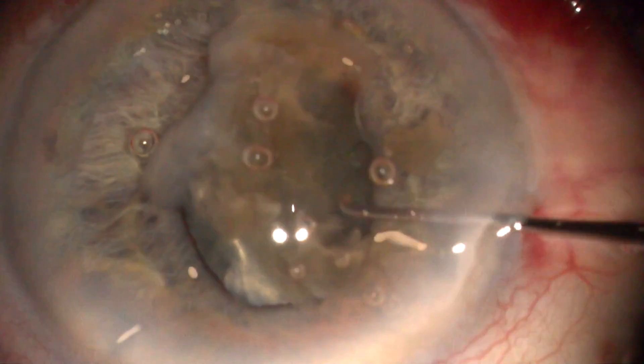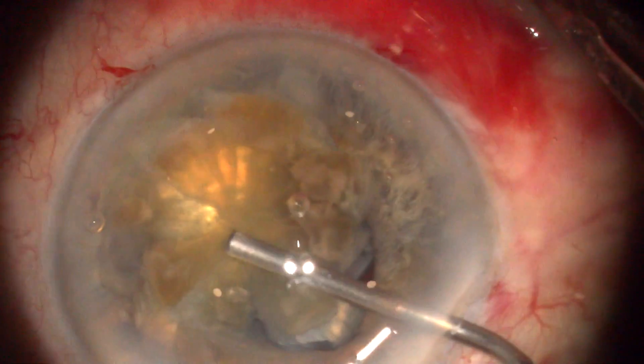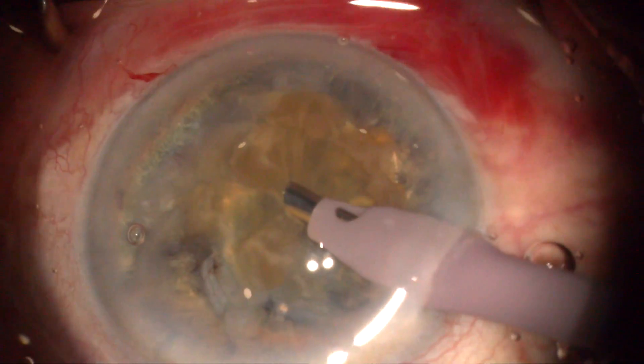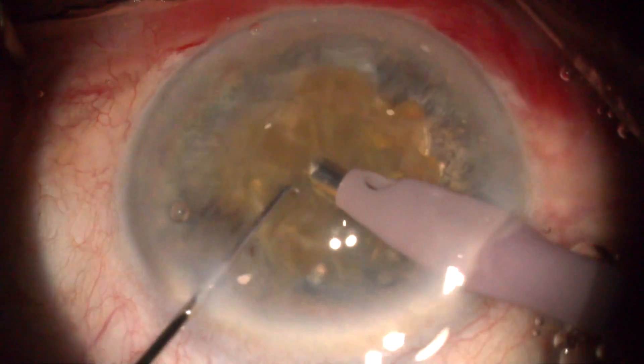Dispersive OVD isolates the posterior capsule. The posterior plate is brought into the anterior chamber for illustration purposes. Small ultrasound bursts in the central area cause the leathery posterior plate to come to pieces in the final stage of the microchop technique.